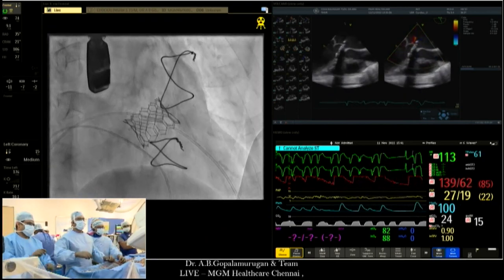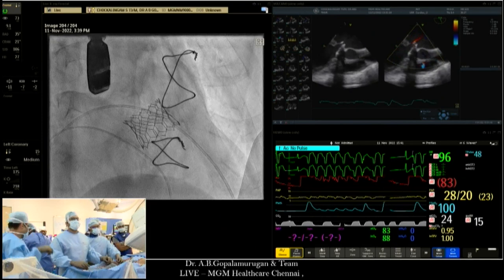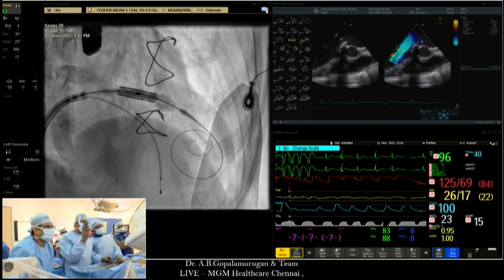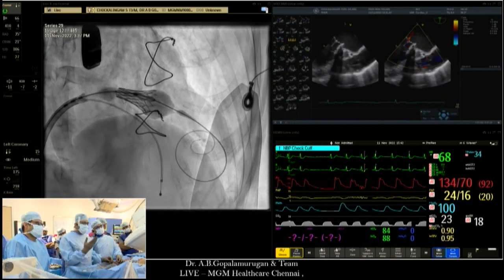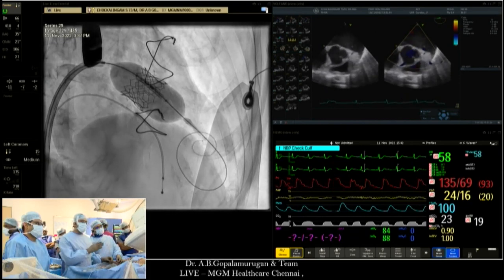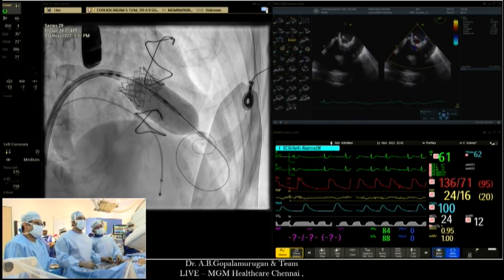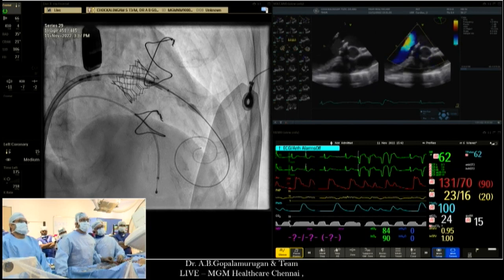Absolutely. That was another dynamic decision that you make. Why don't we show the inflation, please? If I have any doubt that I'm not well flared ventricularly, because if you were to embolize during deployment, the embolization, from my experience, is always more ventricular. Once you deploy the valve, embolization after is going to be atrial because the LV is going to push it. And the only way to prevent it is a good flare. And there, I thought it was less flared. That's why I did a second inflation. You see that? That allows the ventricular portion to be a bit more flared. And that gives me confidence that that valve ain't going anywhere after that.